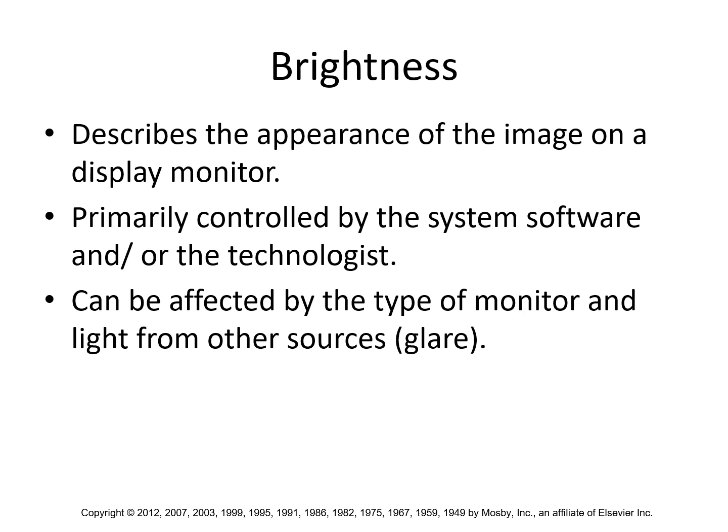You know, the Instagram filters, where you take a picture and it looks good, but I think I could make it pop if I do some edge enhancement and maybe change the shadow colors and the highlight colors and just make everything look pretty. You can do the same post-processing that you can do on Instagram, with the exception of changing the color scheme. You can also do that on an X-ray.